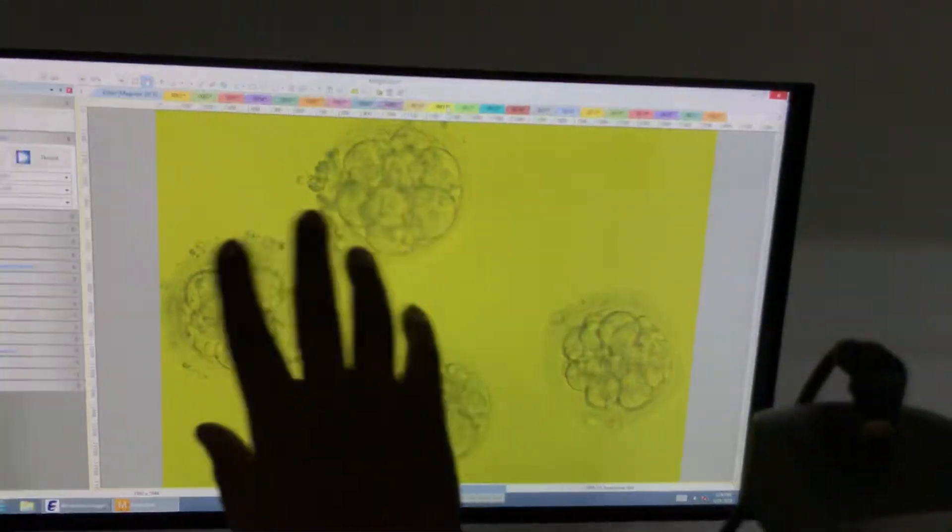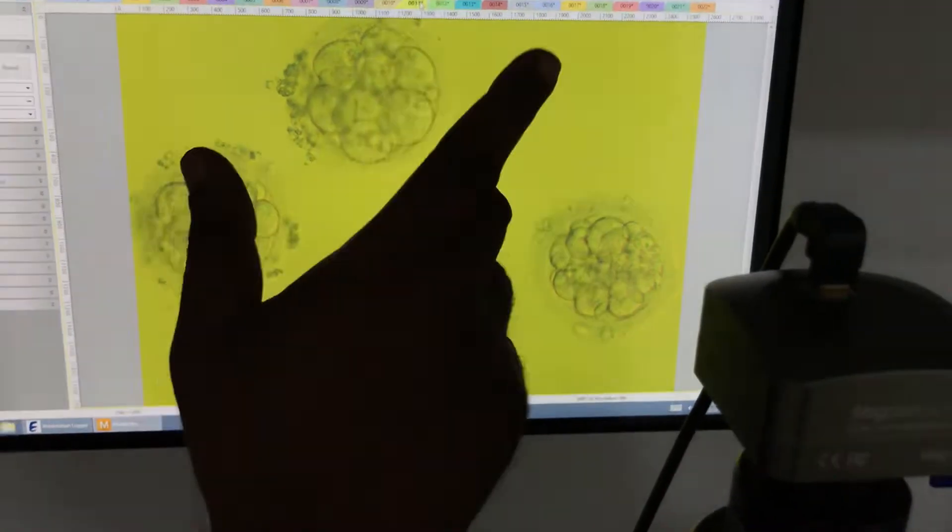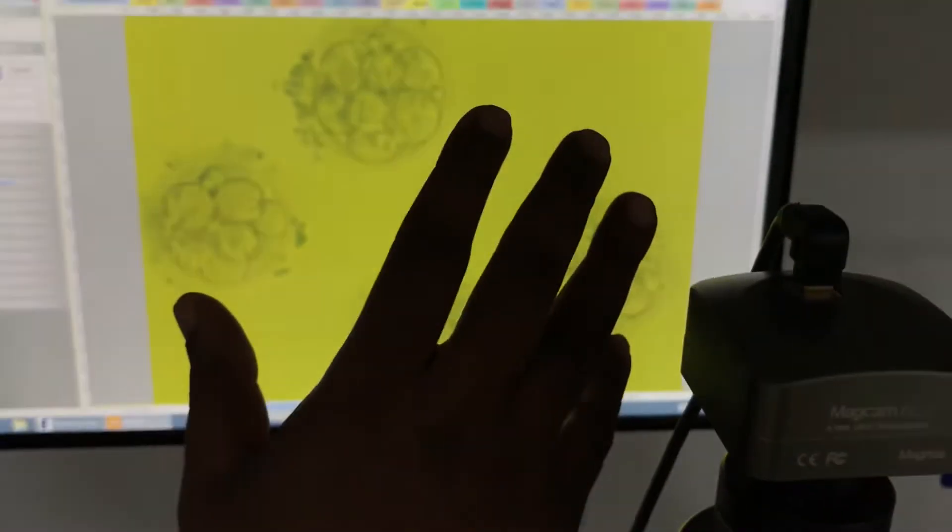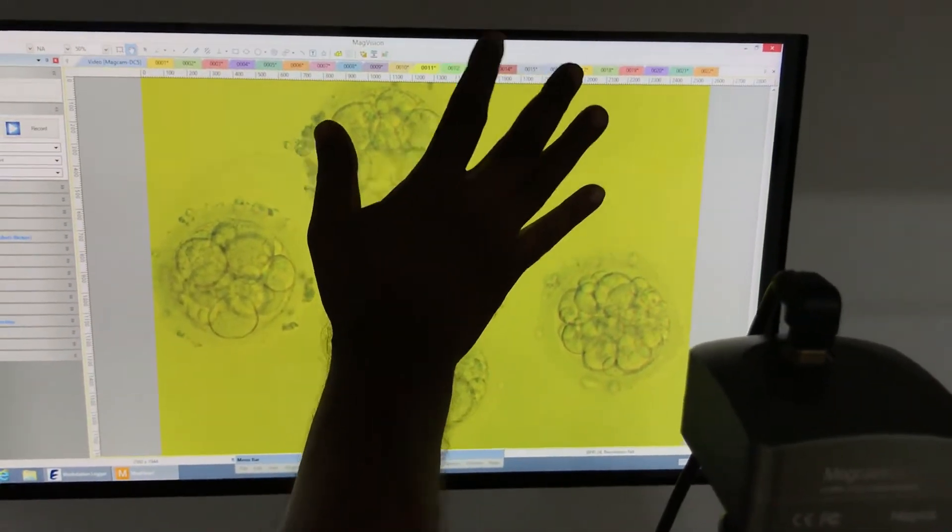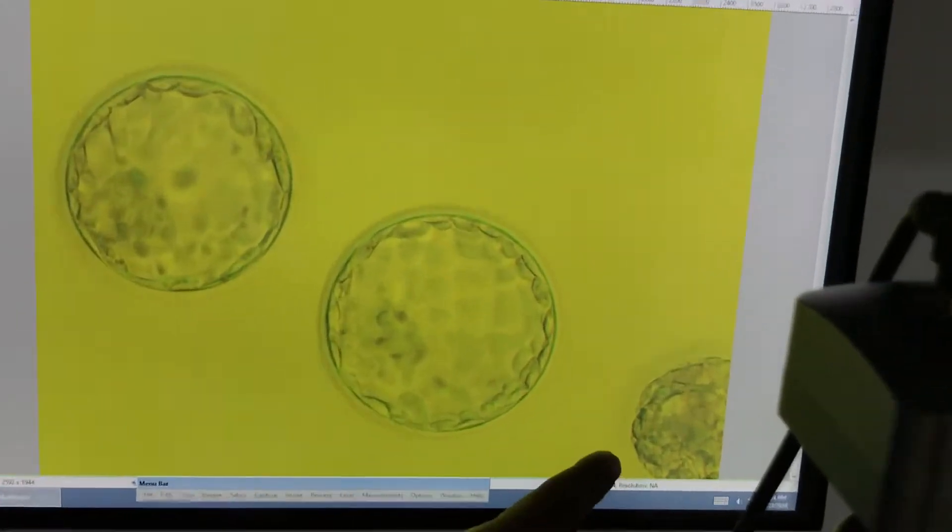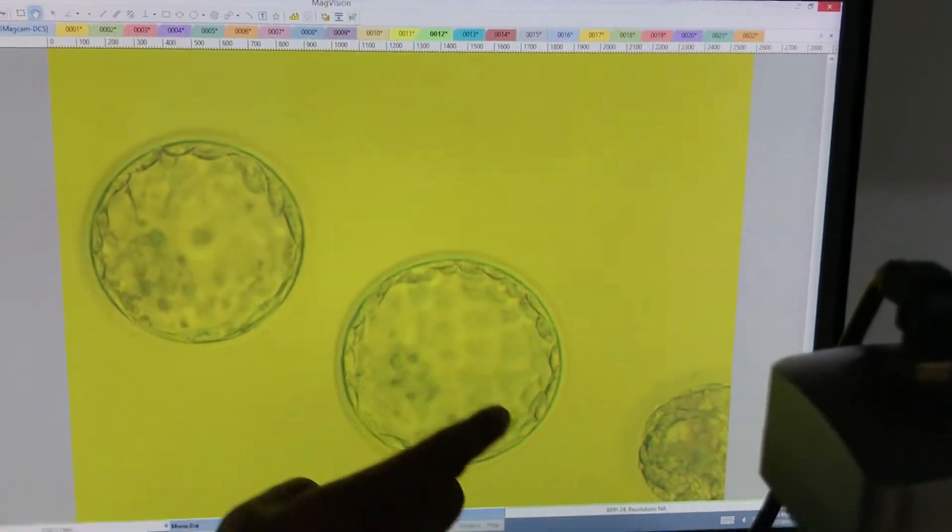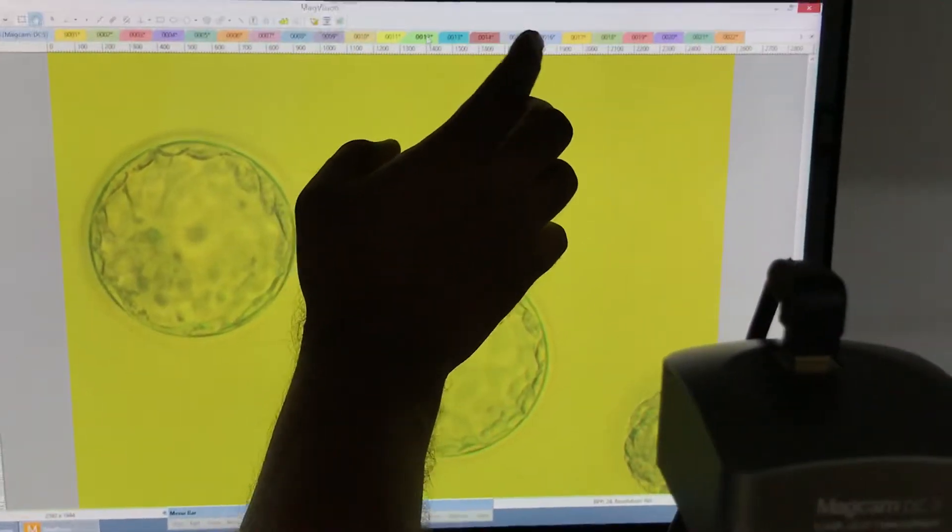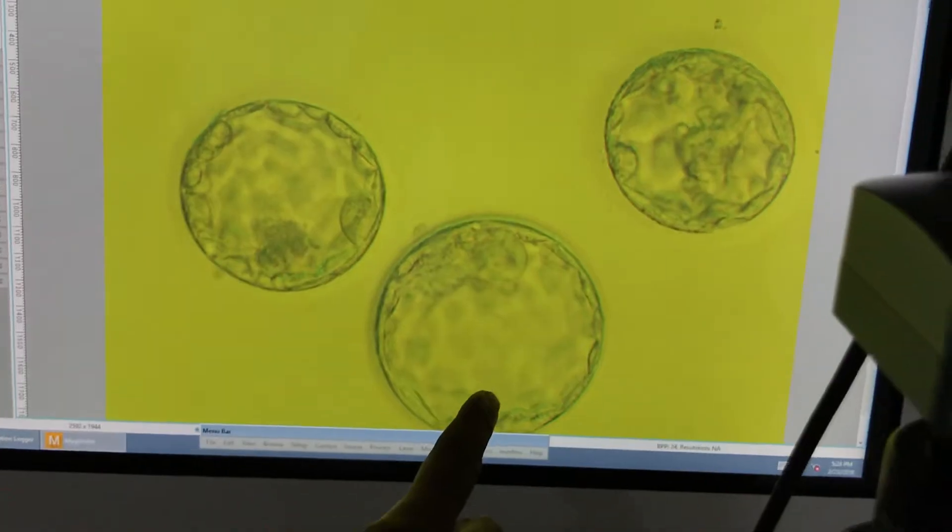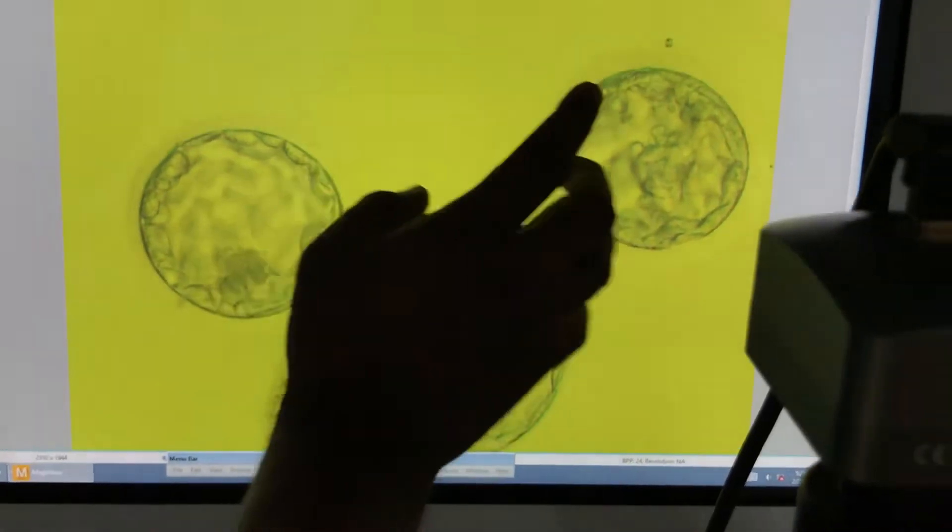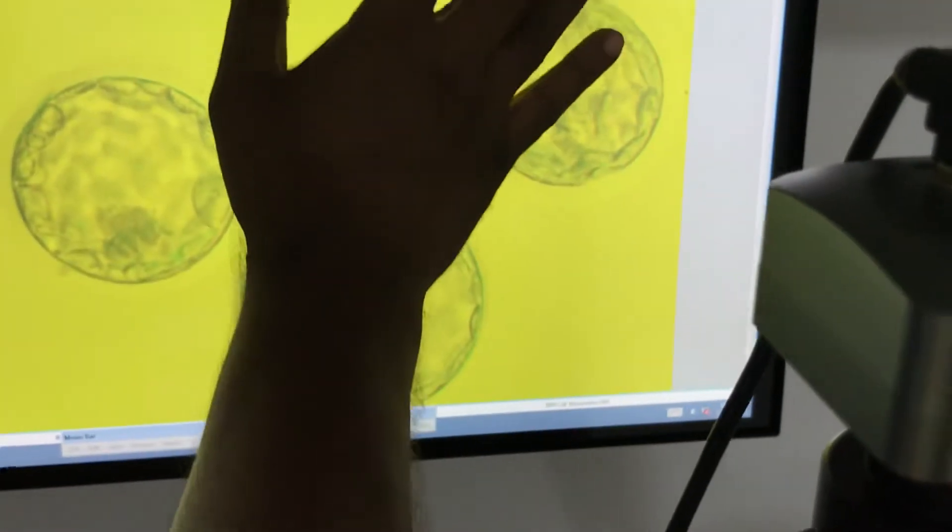We transferred almost ten embryos - one remaining is waiting for the doctor. Now post-thaw: patient number one has 4AA, 5AA, early blast. Patient 13 has 5A, 8-cell, 4AA. This AB looks like AB.